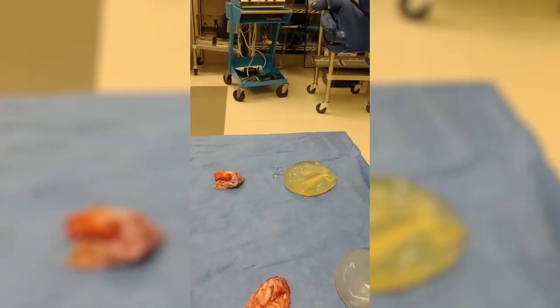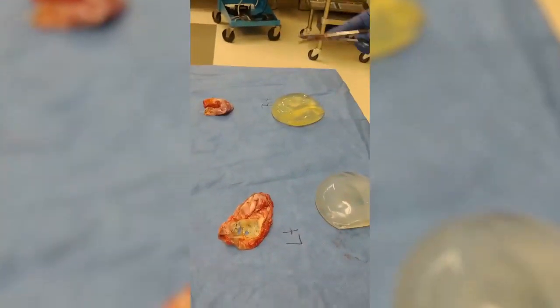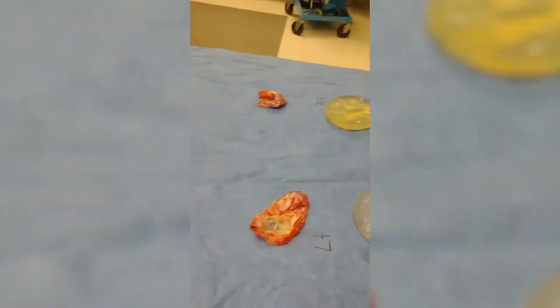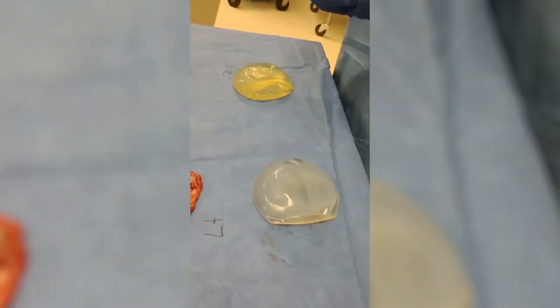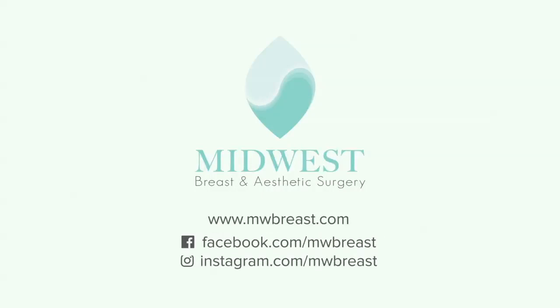We're going to send the capsules for the appropriate pathology and microbiology. But again, this reinforces the importance of an en-bloc capsulectomy.